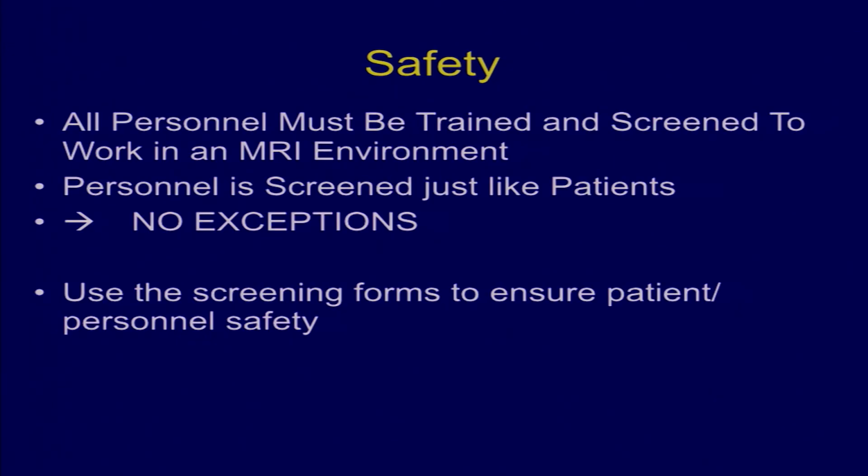And so as a result, a few things. All personnel must be trained and screened to work in an MRI environment. And that means not just patients, but also personnel. If you're working in an MRI environment, you have to be screened to make sure you don't have any metallic objects, which could be a problem.